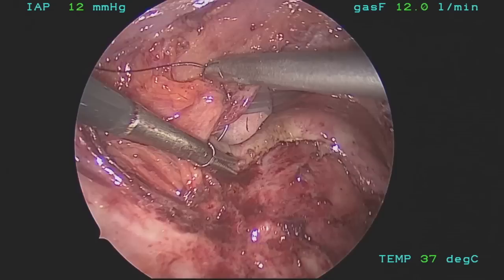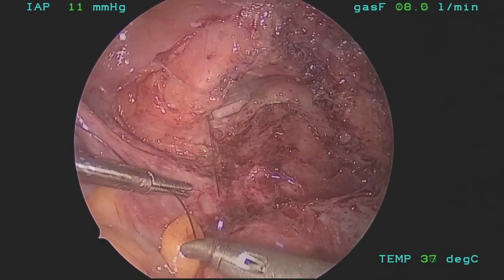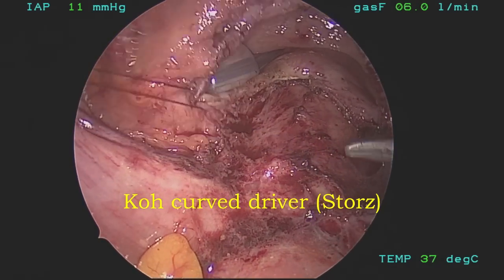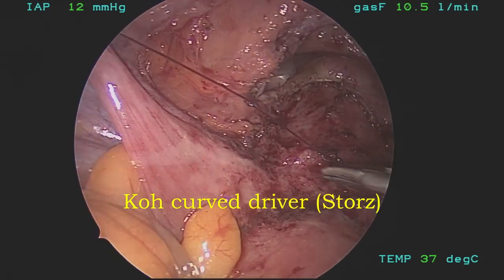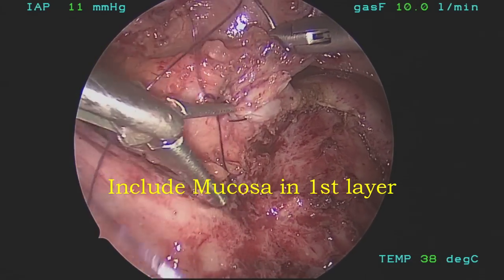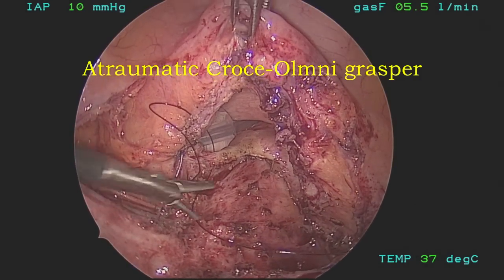Utilizing a 3-0 monocryl or 3-0 Vicryl, the first layer is closed in a running non-locking type fashion. The knot should be incorporated into the abdominal cavity and not into the bladder itself. Permanent suture should never be utilized. The mucosa is included with the first layer. Gentle traction on the tissue is very important.